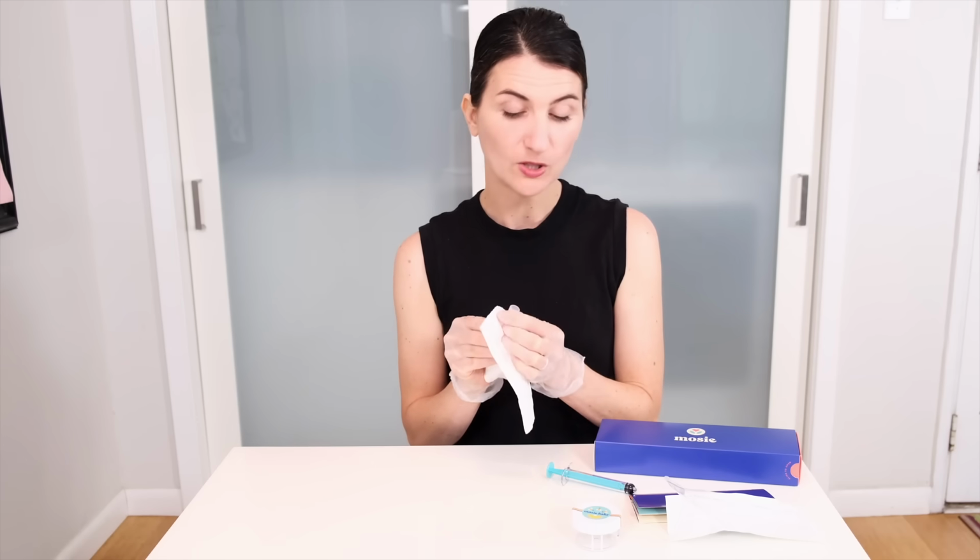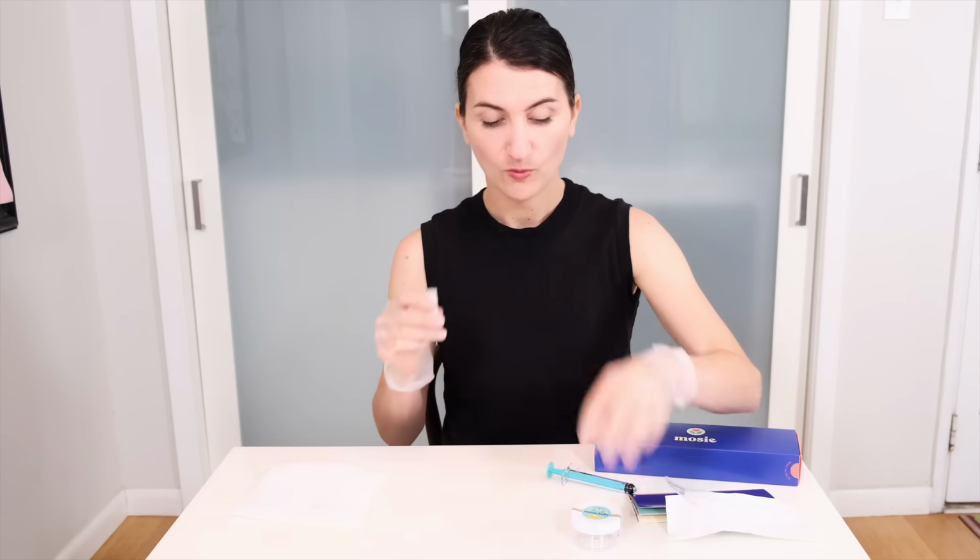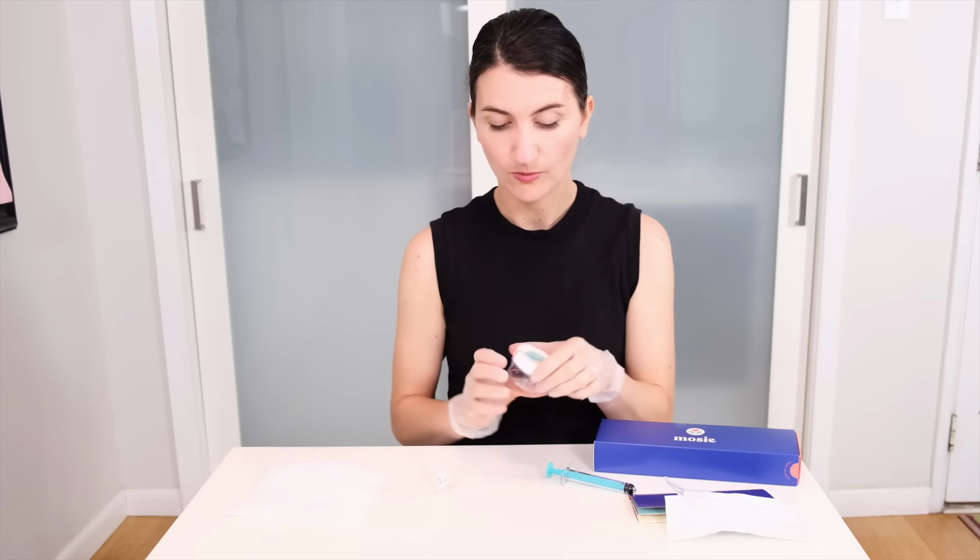You may want to have a paper towel as well. There could be some condensation. You don't want to get any water mixed with the sperm. You want to help those little swimmers survive, and mixing it with water is not a good idea. So we will then get our jar ready.